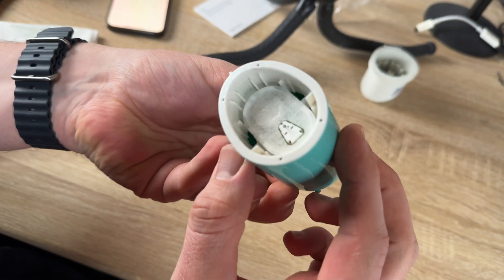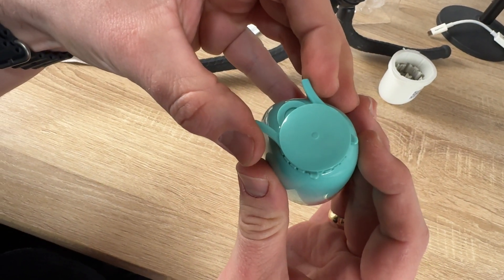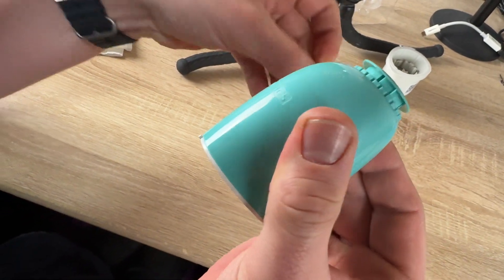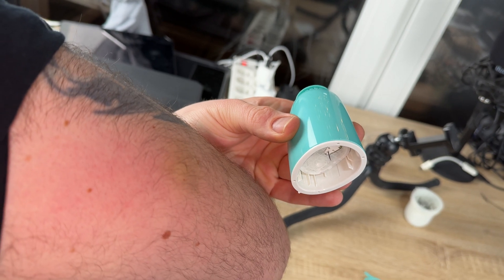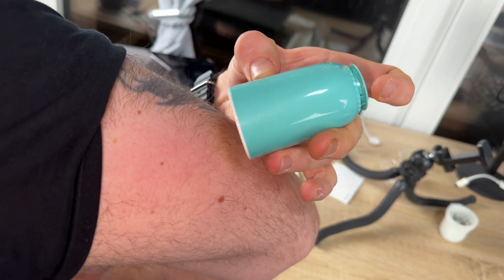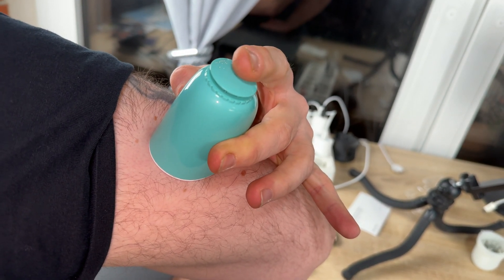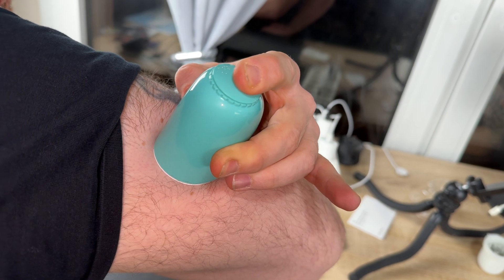The Cybionics GS1 continuous glucose monitoring system is really easy to attach to your arm. It goes on fast and pain free — you only have to attach it once to the upper arm on the back side, and then you can track it for 14 days.